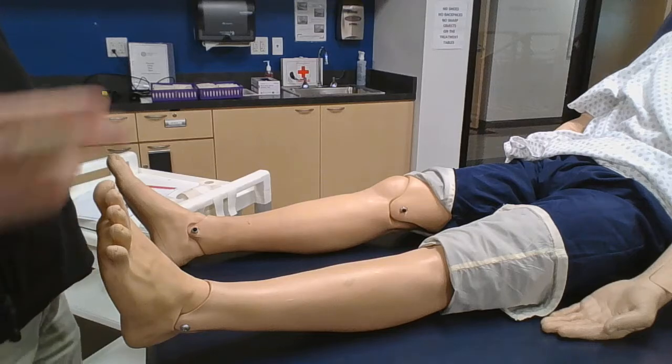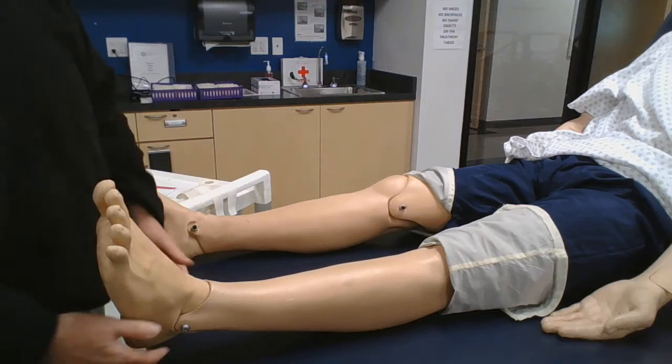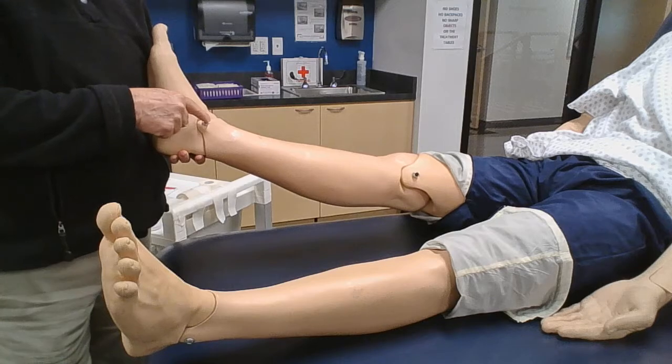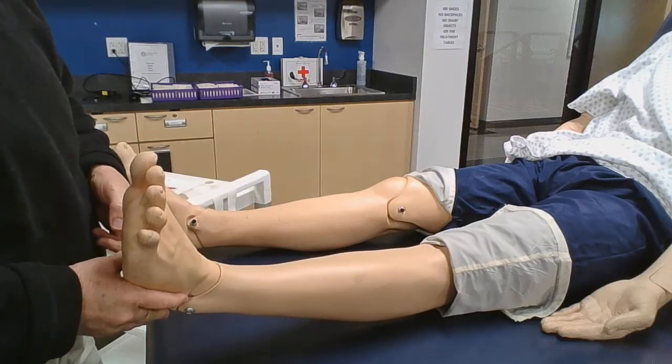We want to check the TP. That would be the medial side, below the medial malleolus. Remember your sustentaculum tali? I love that word. Come just to the sustentaculum tali, just a little inferior and posterior, and there you've got your TP pulse. Show you that again, of course. Joe just has a big giant bolt here. But you'll be checking that both sides, and giving yourself time to do that, you guys.